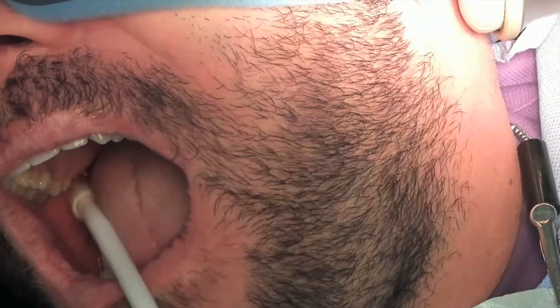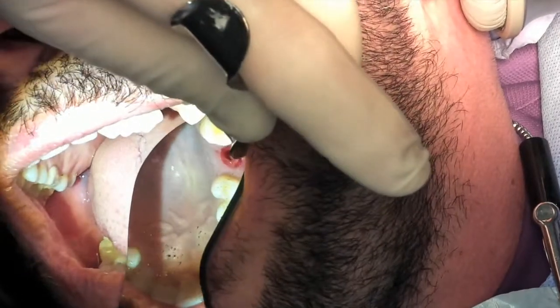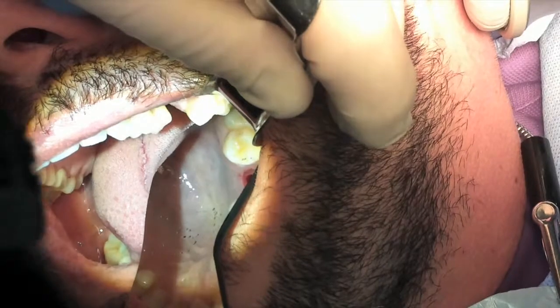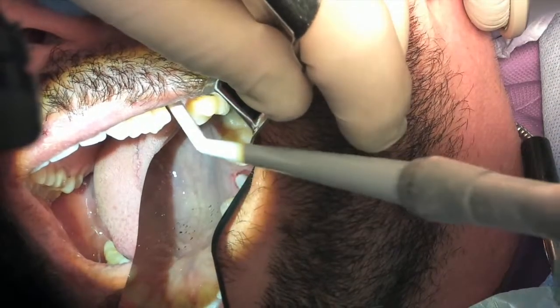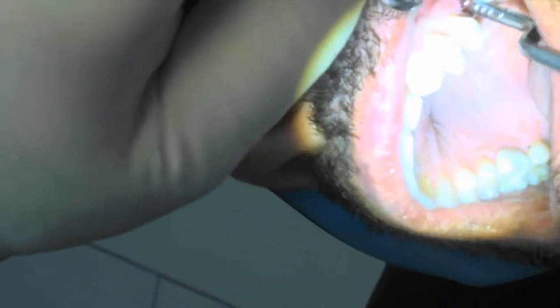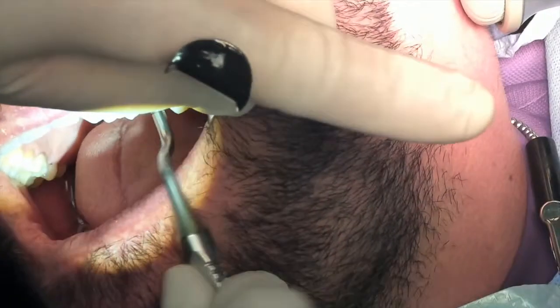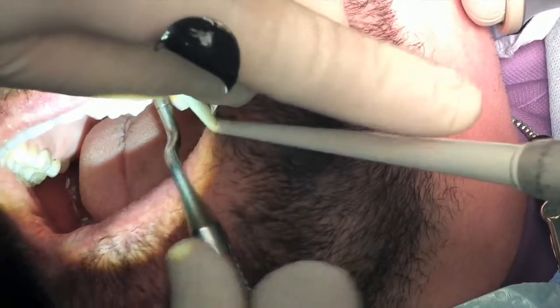Now, the other beautiful thing about this, too, one more time, Ian, suction. Give me a break in a second, man. It's done, okay? So you can see the floor of the sinus is right there. One more time, Ian. Perfect. And the 10 millimeters now. Go back. Suction for me. Okay, now we're right there at the 10 millimeters, okay? So that's perfect.